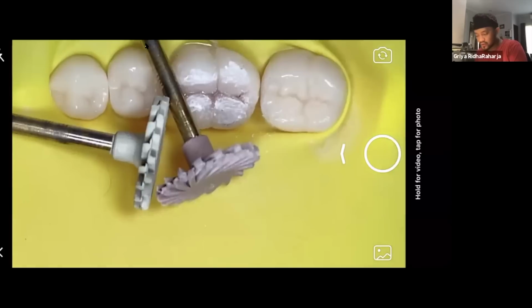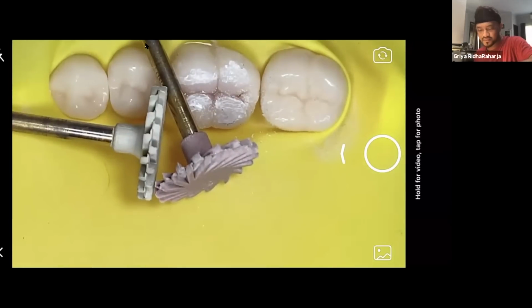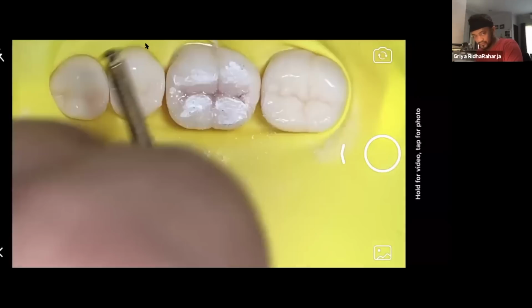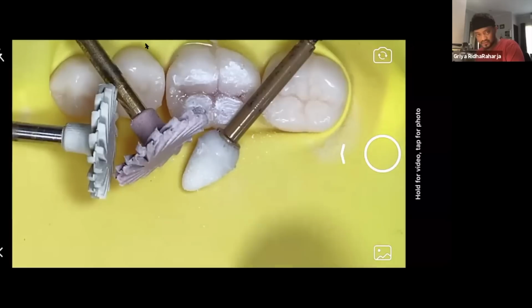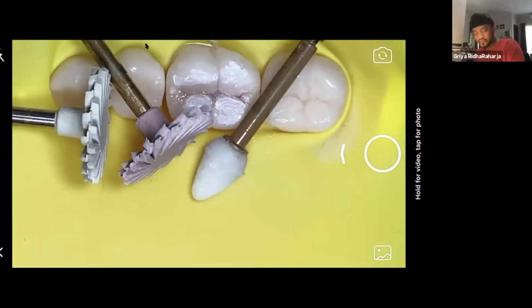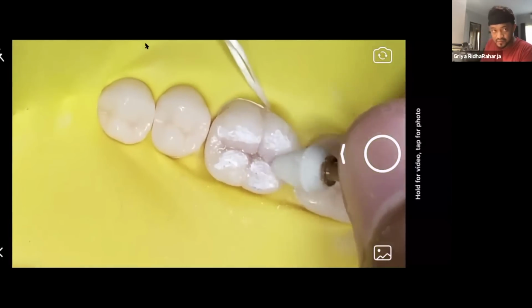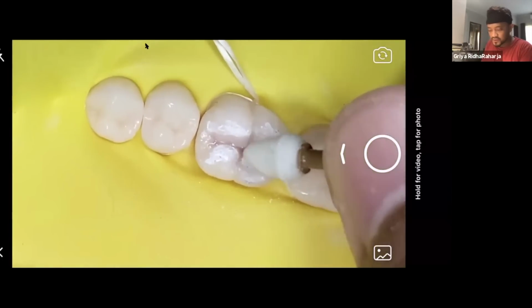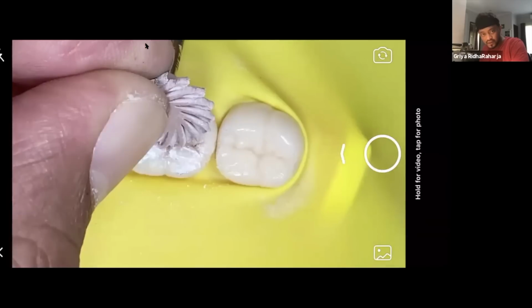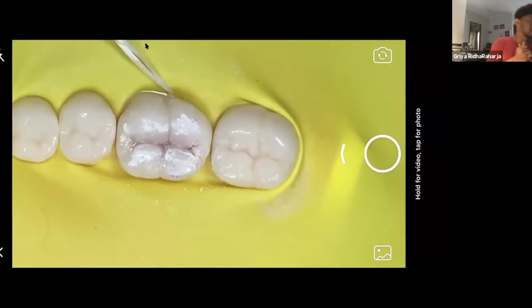So this is the Diacomp, the red one and the gray one. Sometimes I need my second rubber. This is from Enhance. See, Enhance, then Supply, and this is the Diacomp. So posterior, sometimes you cannot reach the groove, okay? So with this, it's possible to reach the groove. So like a twist, see? So I will combine them.